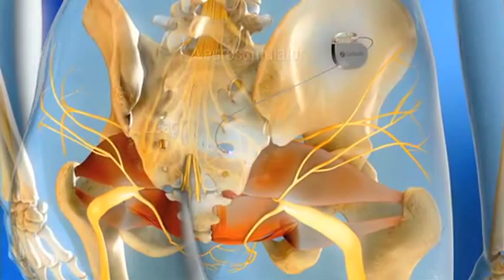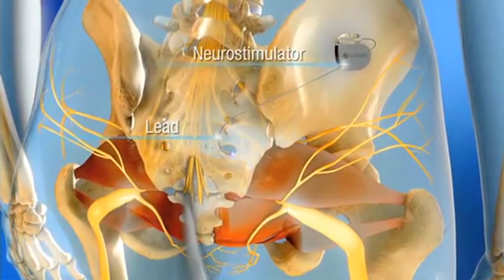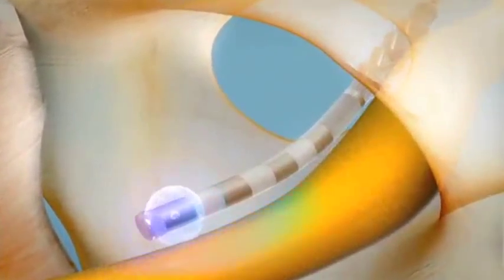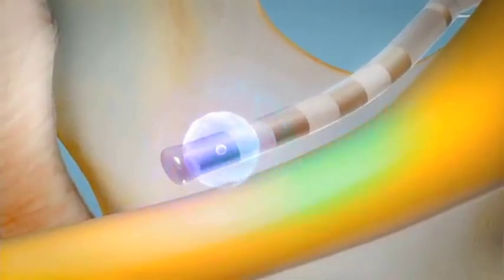Medtronic sacral neuromodulation delivers electrical stimulation to a sacral nerve via an implanted neurostimulator. The neurostimulator provides an electrical charge to an area near the sacral nerve, resulting in altered neural activity.